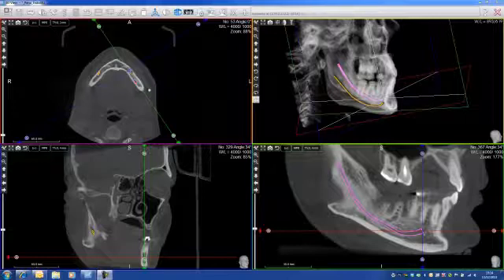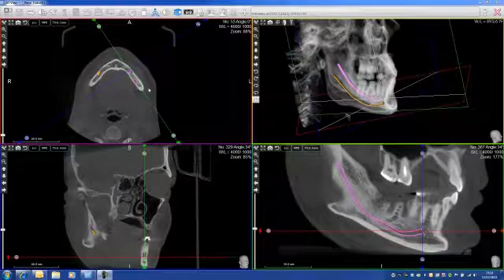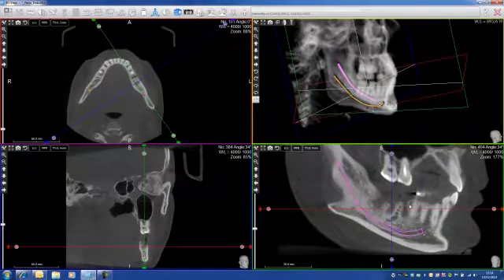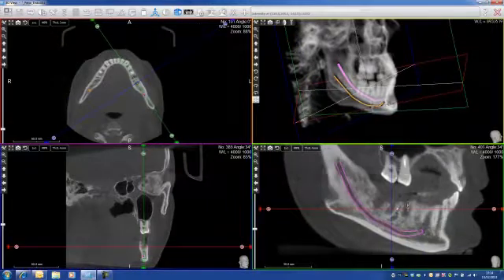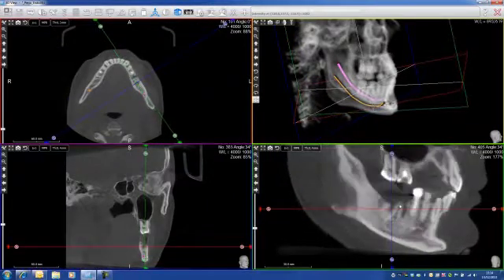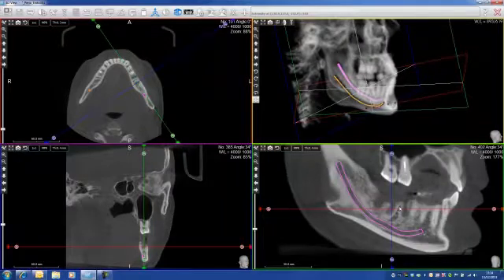Now, I know exactly where my nerve is. So let's place an implant. As you can see here on this view, I don't have much teeth. So what I can do is pretty much place one, two, or three implants here.